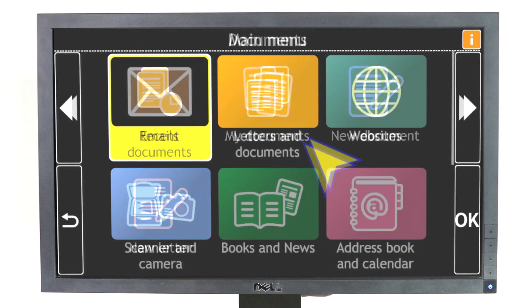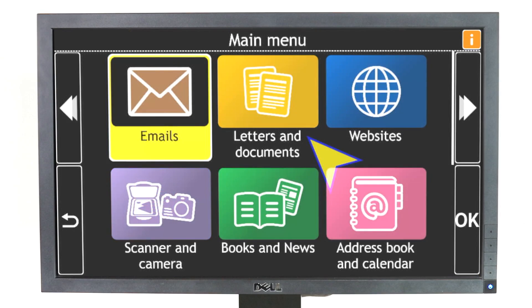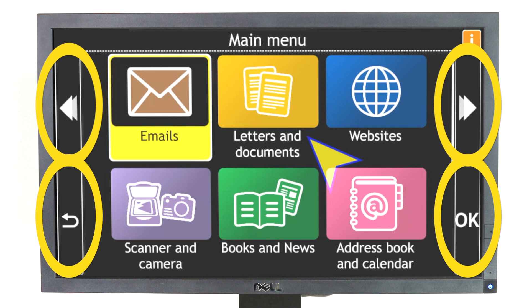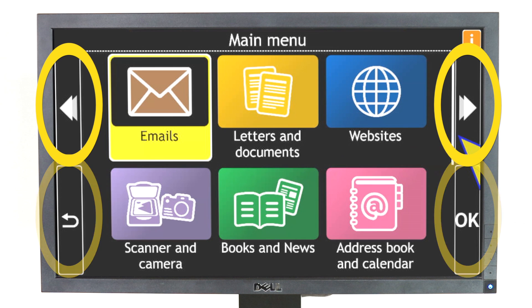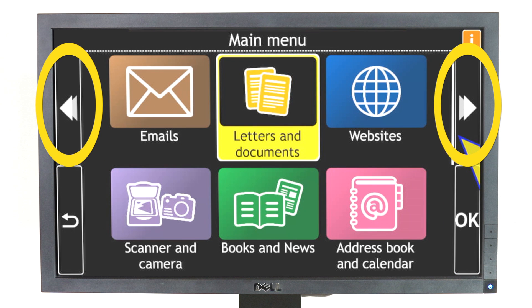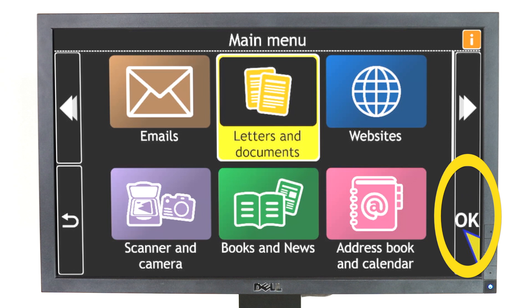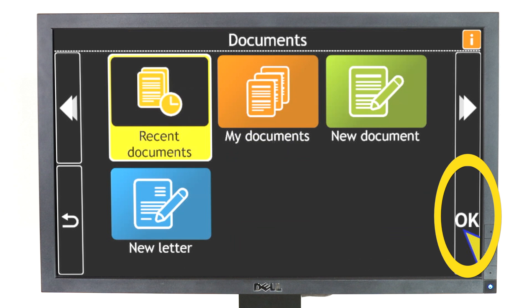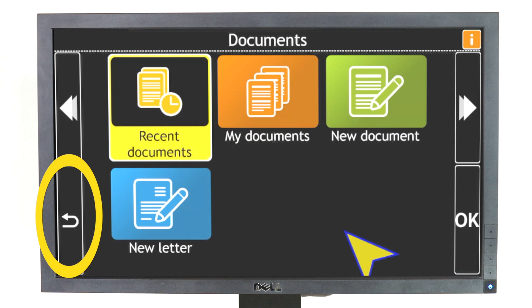You can also control GuideConnect by using the side buttons located at the edges of the screen. Click the Next and Previous buttons to move through the items. Click the OK button to select an item. And click the Back button to go back to the previous screen.